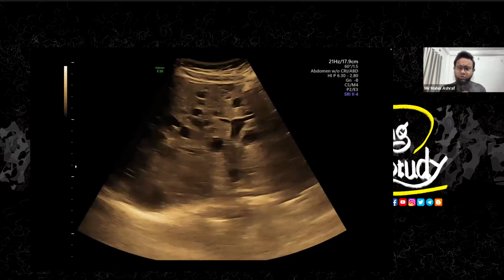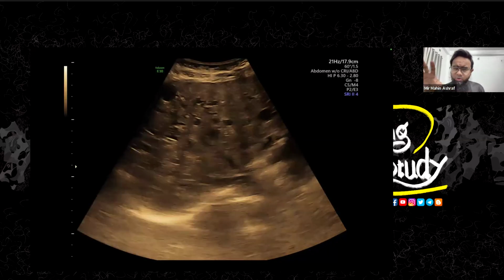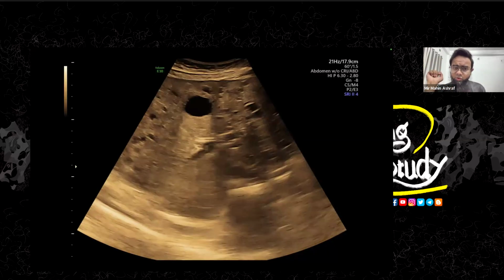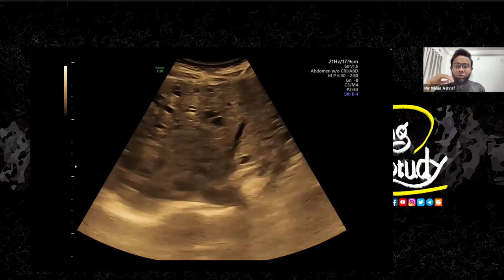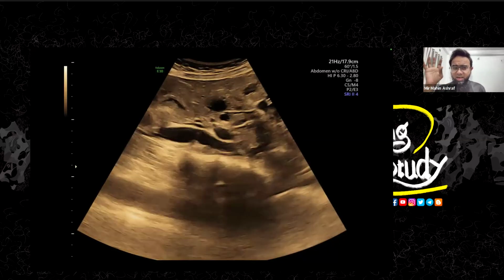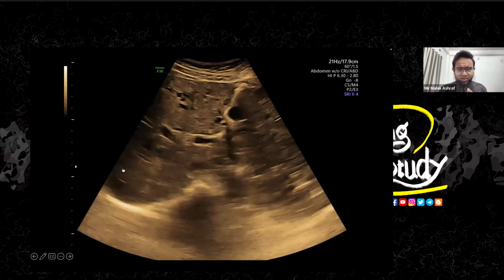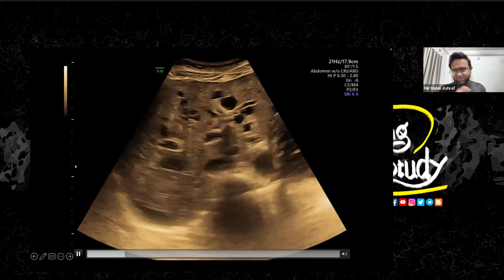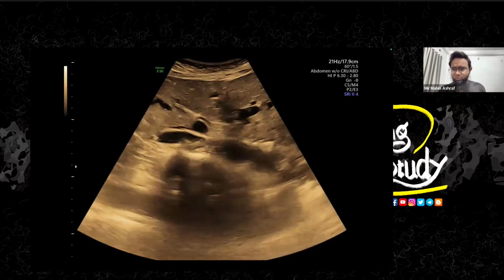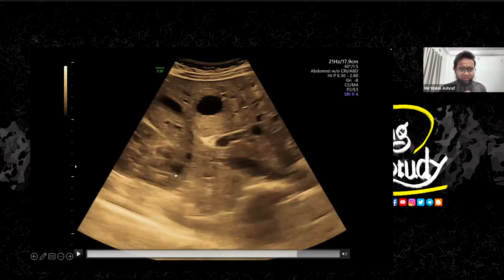So we don't want to go for that. But if you are looking at the liver with this type of cystic lesions, you definitely should look at the kidney also. So we jumped into the kidneys and found cystic structures of similar appearance within the kidney. You can see a glimpse of the right kidney here. I didn't take the picture of the kidney during the scanning, so I can show you the still pictures. Just freezing the image, you can see a glimpse of the kidney, but this is not a good one.